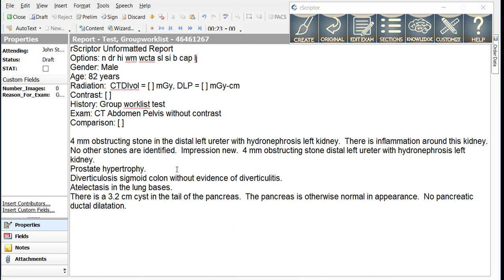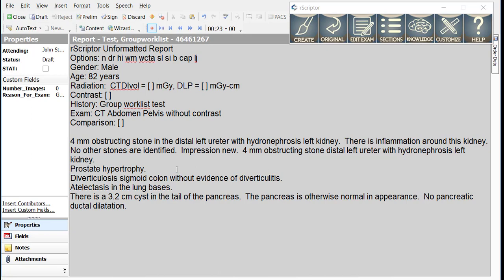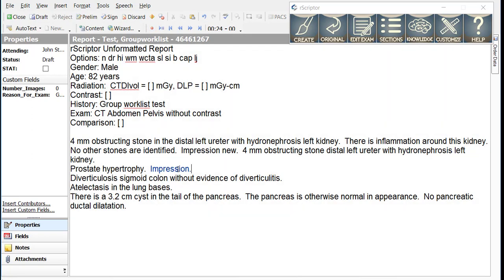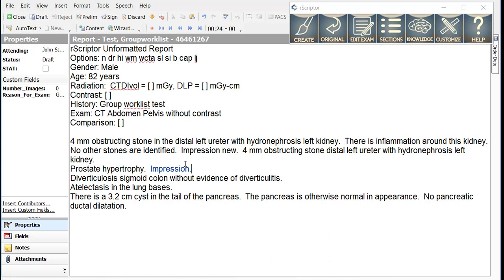The next finding we have is Prostate hypertrophy. Let's simply add impression period to that line. So by the logic we discussed, this text will go into the findings and impression. We did not put anything after impression, so there will be no additional text going into the impression section.